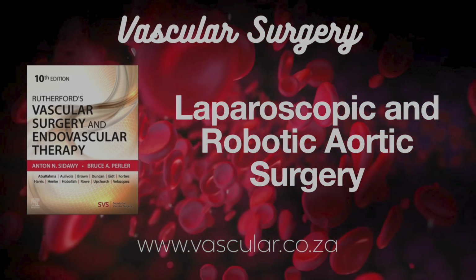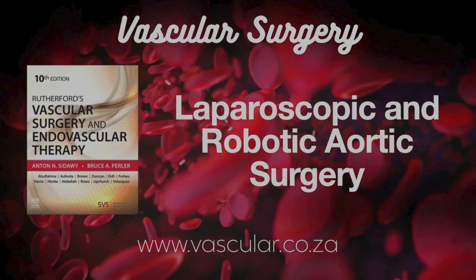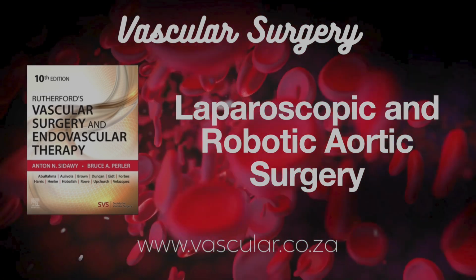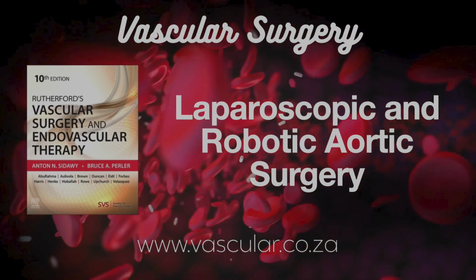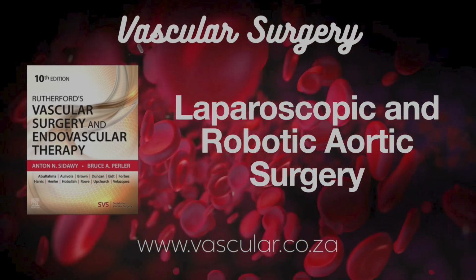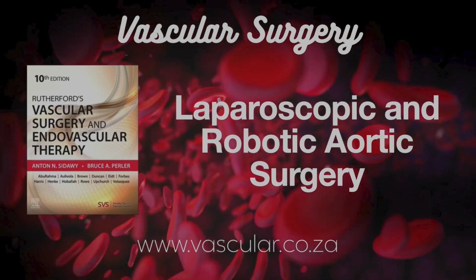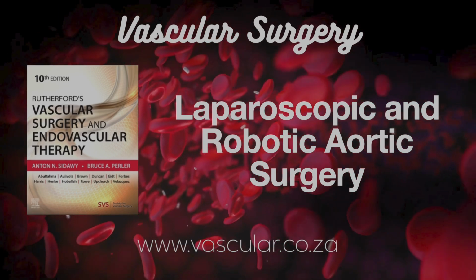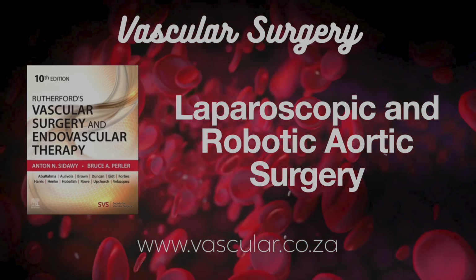Okay, so despite smaller scars, the overall physiological impact and recovery might not be drastically less than open, and certainly more than endo. What's the final word from Rutherford's on laparoscopic aortic surgery? The conclusion is it can be safe and effective with decent outcomes, but patient selection has to be meticulous, surgeons need deep experience, and they must be ready and willing to convert to open if things get difficult.